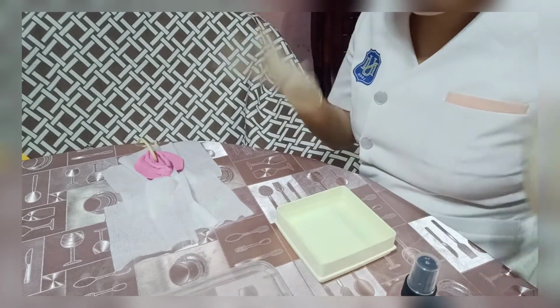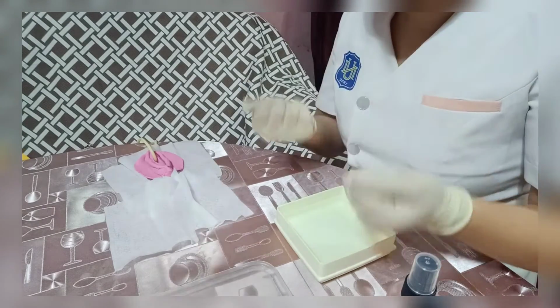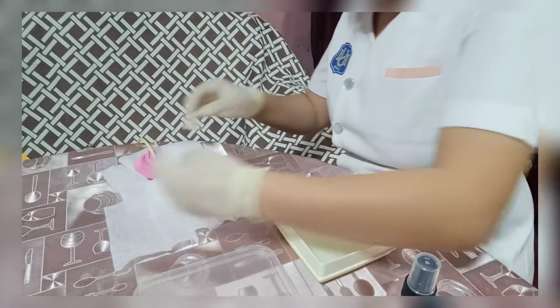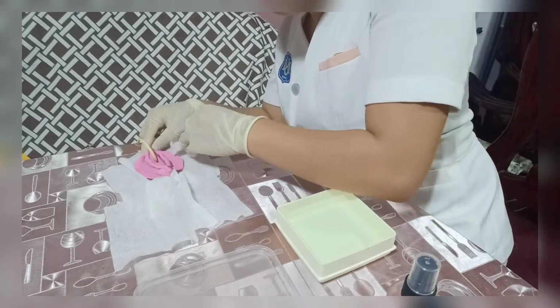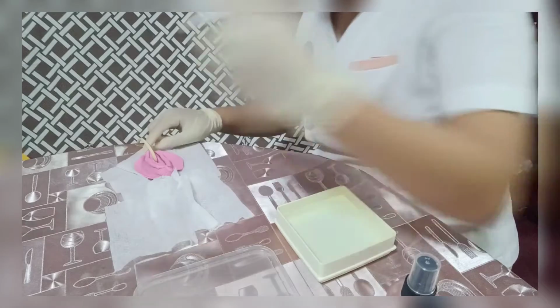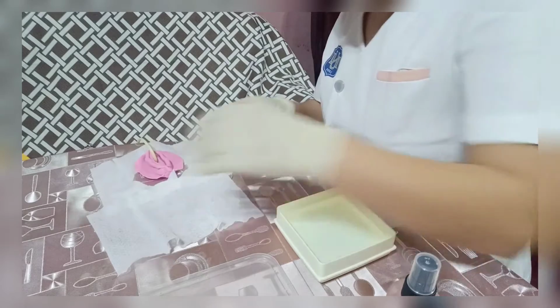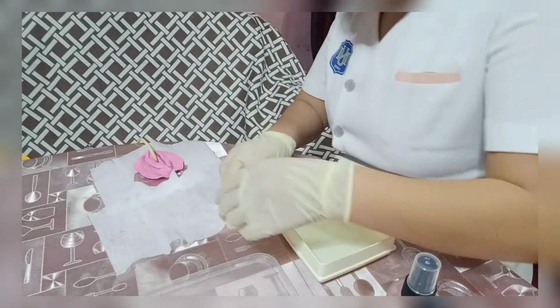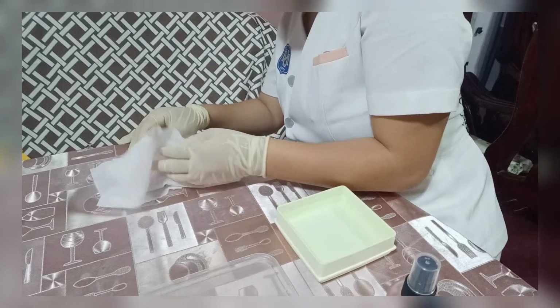Then get also a washcloth to clean the groin and leg. Imagine that this is the leg and groin of my patient. And then pat dry our patient's vagina.